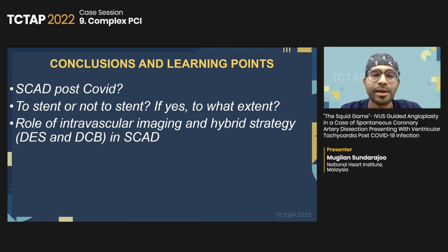So we decided to use a hybrid strategy here with the usage of drug-coated balloon and also drug-eluting stent. And yeah, the usage of IVUS was truly a game changer here. First, in making the diagnosis, and secondly, in confirming the wire position that we are truly in the true lumen. Thank you very much. And nice presentation, good solution.